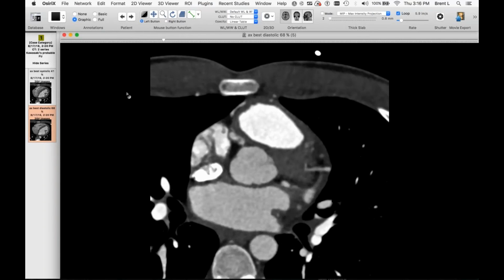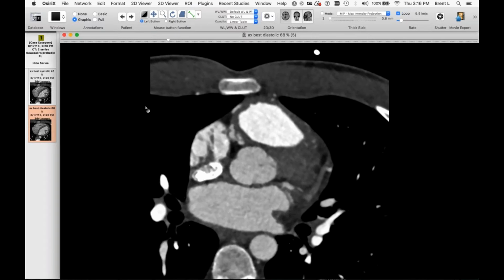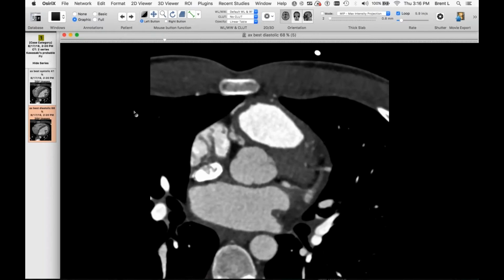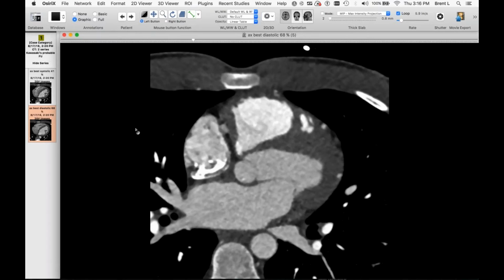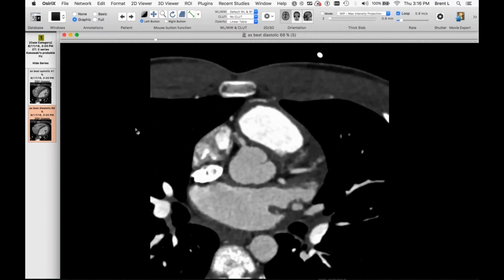I mean, the proximal RCA was so abnormal that at first it was thought that there could be a fistula here to the right atrium, but on cath that was not really borne out. Just very irregular RCA there. That was presumably due to some occlusion of an aneurysm that may have partially recanalized. But I just thought this is a nice case, presumably of Kawasaki disease in this 14-year-old.